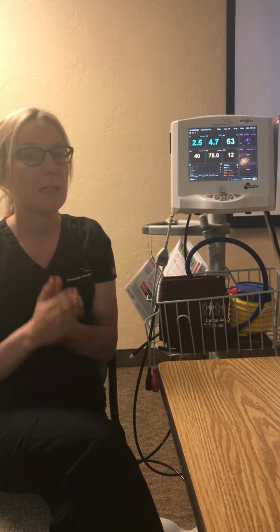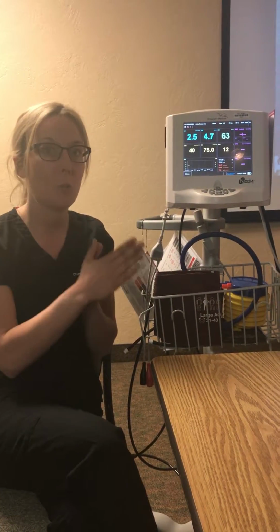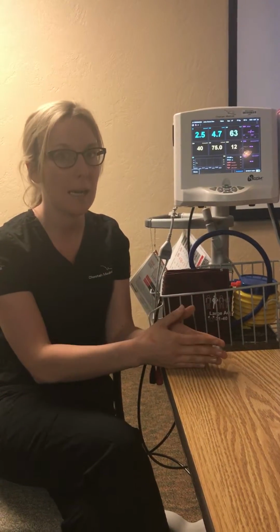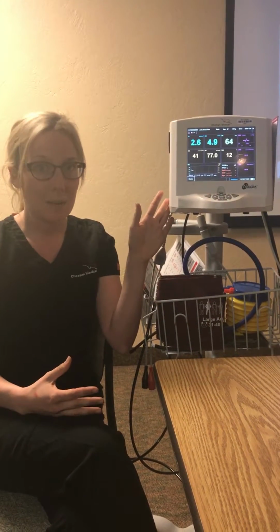We have a lot of patients that present overloaded when they're actually intravascularly dry, and vice versa. This is just an extra piece to the puzzle for us to make sure we're choosing the right lever of flow to manipulate to make sure we're perfusing the best that our patient can. There are studies that are showing decreased length of stay, decreased ventilator days, decreased mortality by using dynamic assessments, because dynamic assessments are better over static, like blood pressure. And we can monitor patients without doing the passive leg raise and the bolus test.